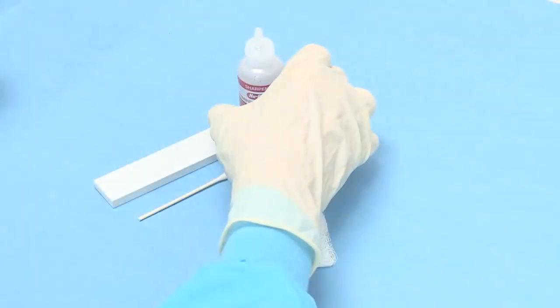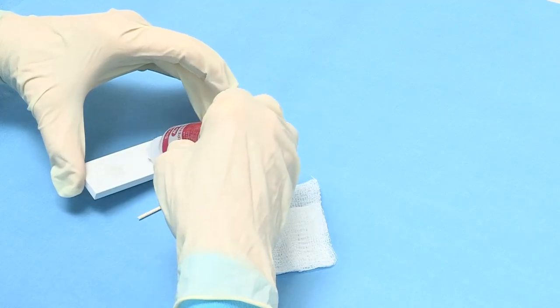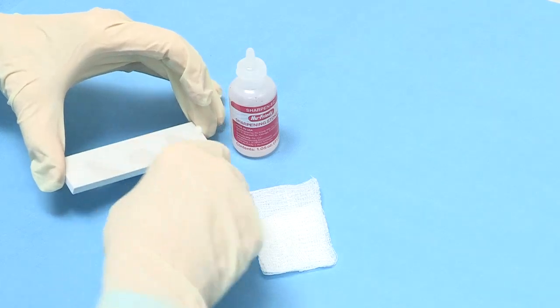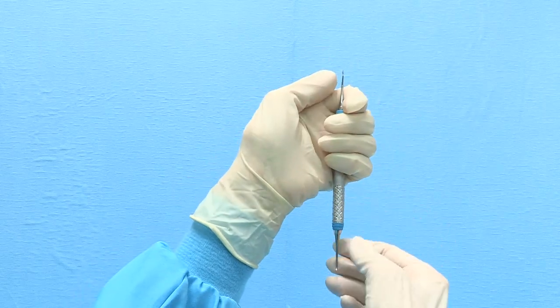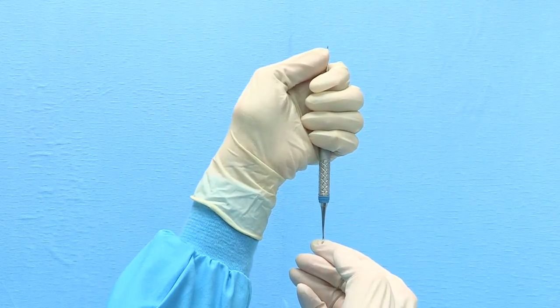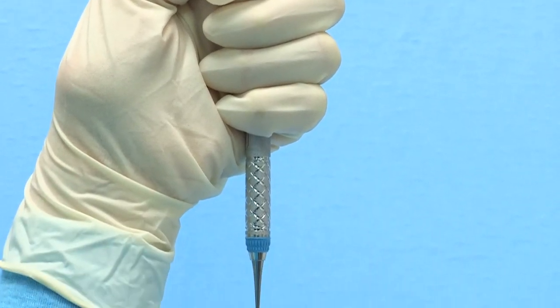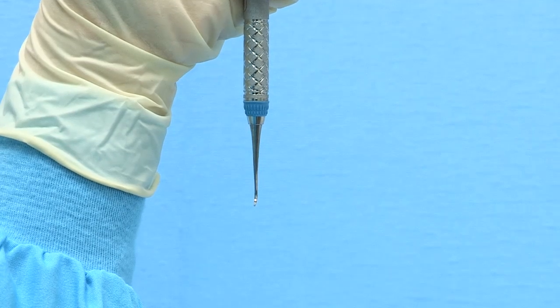To prepare the Arkansas stone for sharpening, apply 2 or 3 drops of mineral-grade oil onto the surface. Spread the oil on the stone with your cotton-tipped applicator. Hold the sickle scaler in your non-dominant hand with a secure palm grasp. Brace the top shank with your thumb and place your elbow directly in front of you on a flat or stable surface. This positioning of your thumb is very important, as it will counterbalance the pressure that will be applied when sharpening the lower blade.